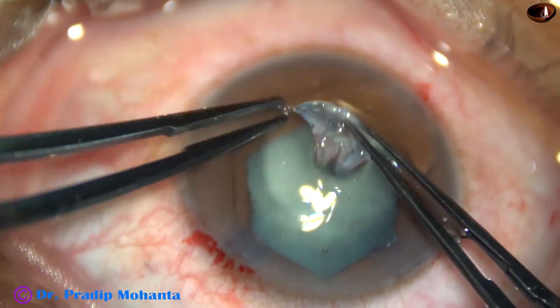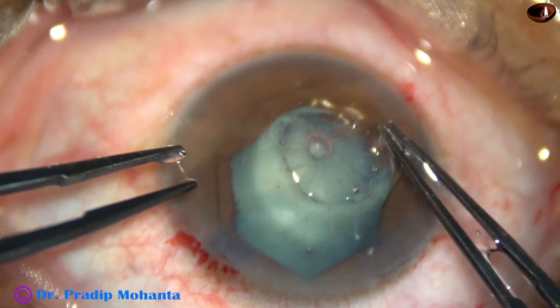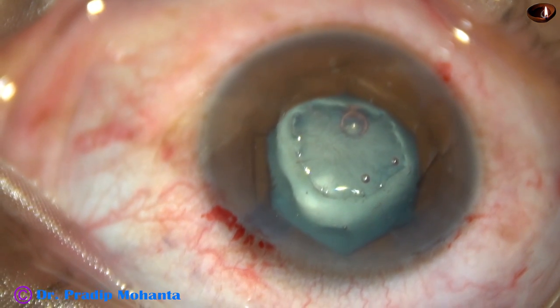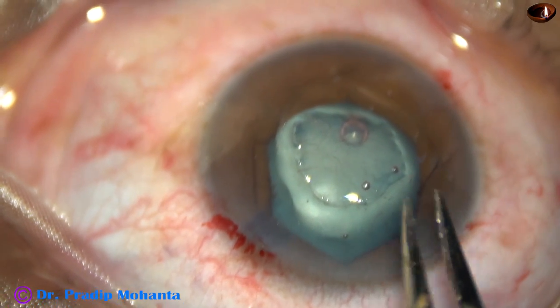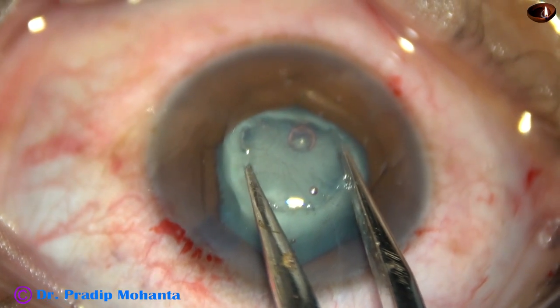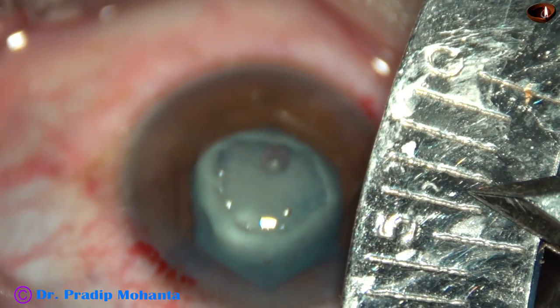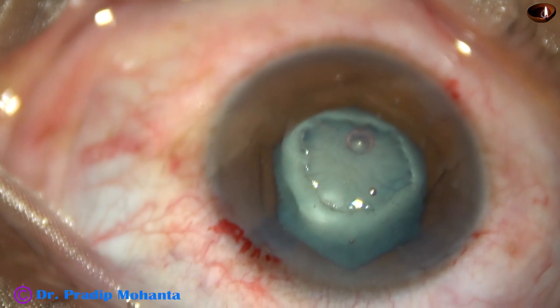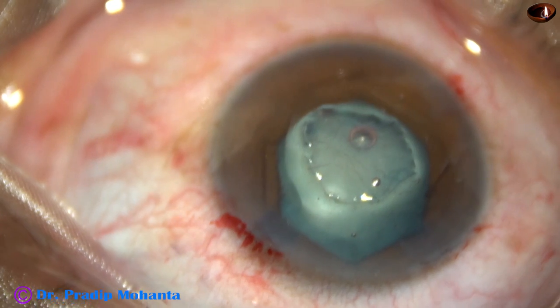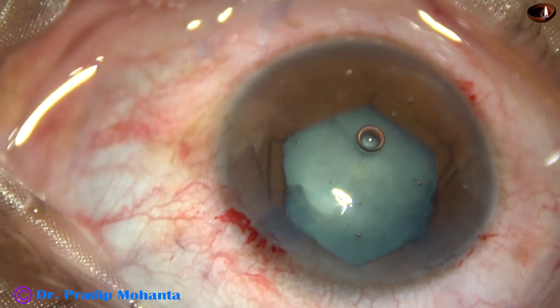Let us see how big this fibrous plaque is. I have spread it over the cornea. I have asked for a caliper — I am opening the caliper and it is of this size. This is about 4 millimeters. So the fibrous plaque is about 4 millimeters and the size of the rhexis is not more than 5 millimeters.